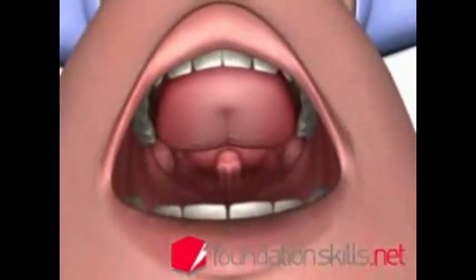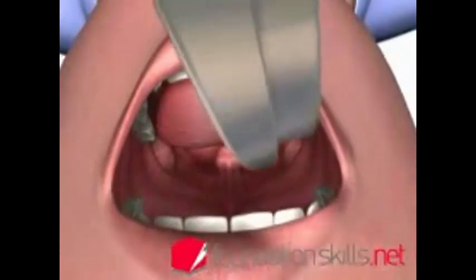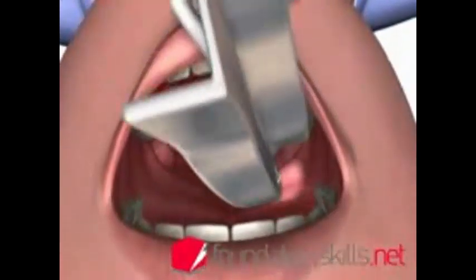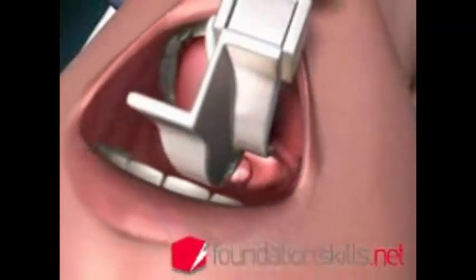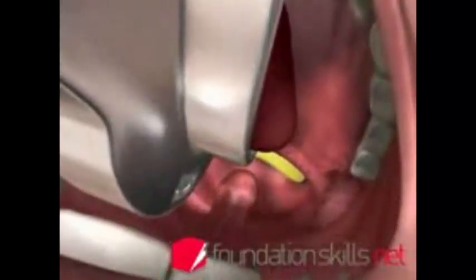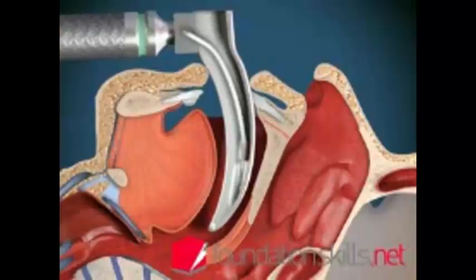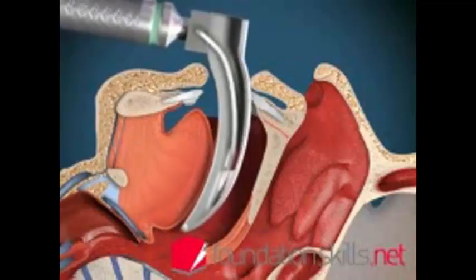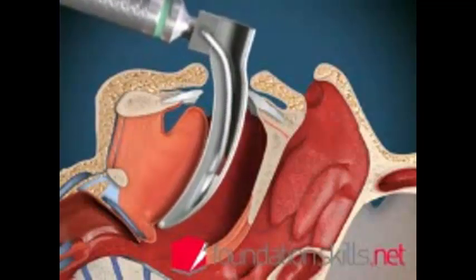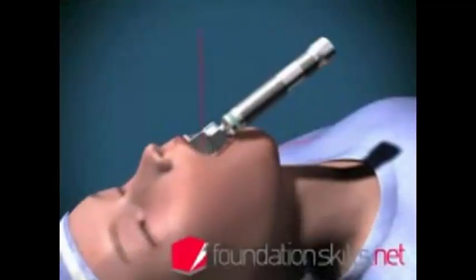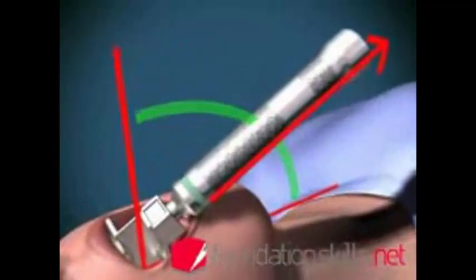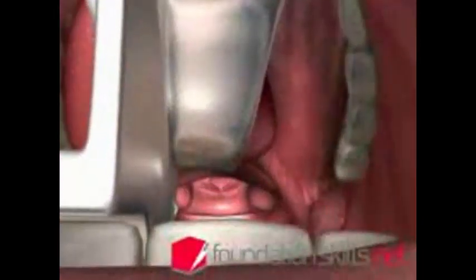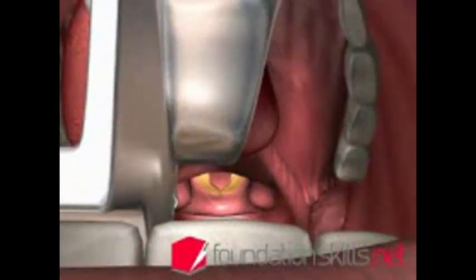insert the curved blade of the laryngoscope into the mouth over the right side of the tongue, displacing it to the left and upwards. Advance the laryngoscope until the tip of the epiglottis can be seen posterior to the back of the tongue. Advance the tip of the blade into the vallecula between the epiglottis and the tongue. With the handle pointing away at 45 degrees, lift upwards and away to display the vocal cords and laryngeal opening.